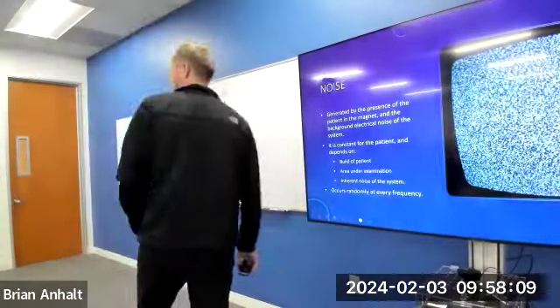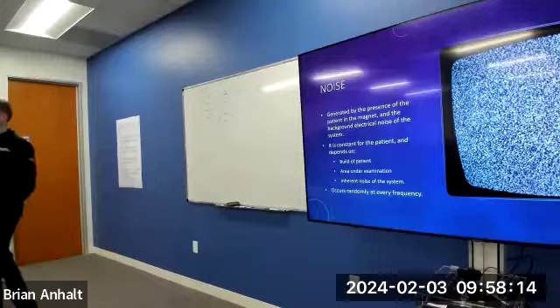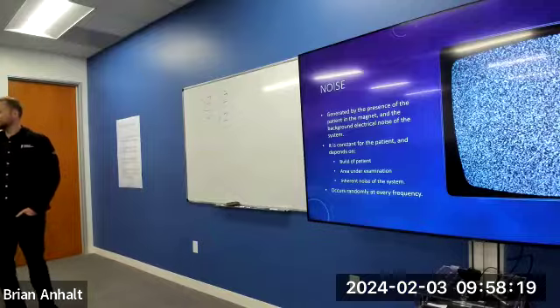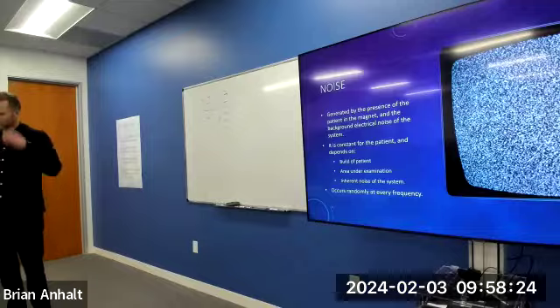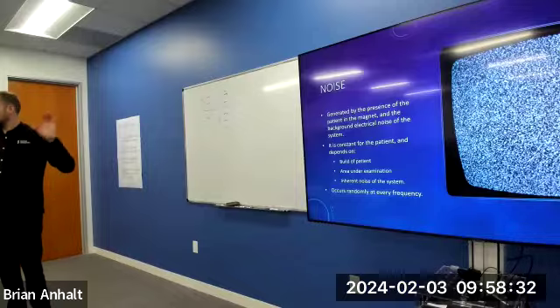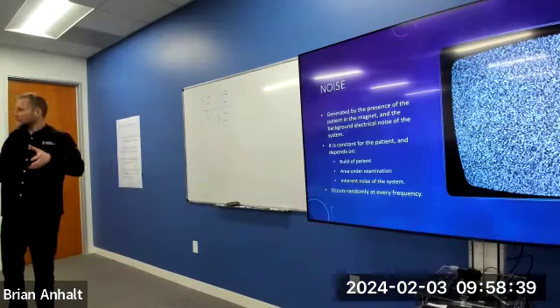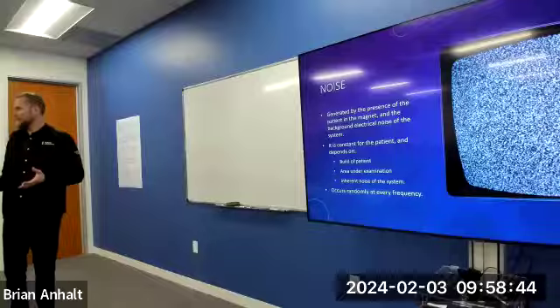Are you adjusting these parameters while you're scanning or after the sequence? If you're gonna adjust parameters, it's before you start the sequence. So how do you know you have noise? Well, you won't until you see the images. So remember, I said at the beginning, we're not adjusting these typically as we go, right? These parameters are set. They're saved there. We make adjustments if we need to after the sequence, alright?